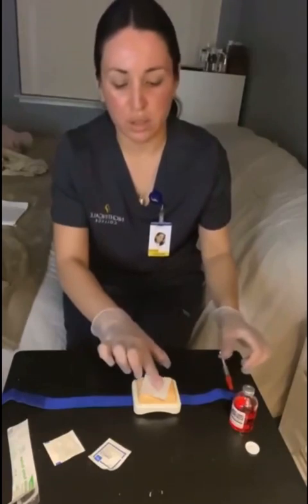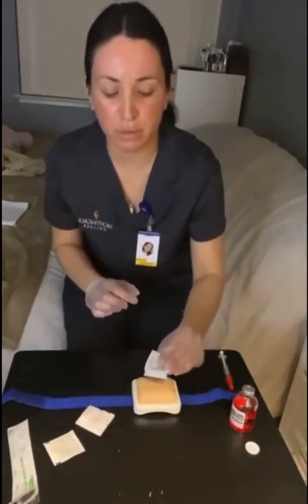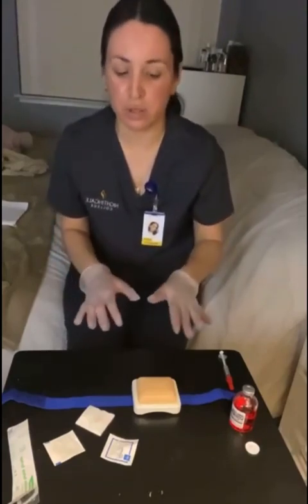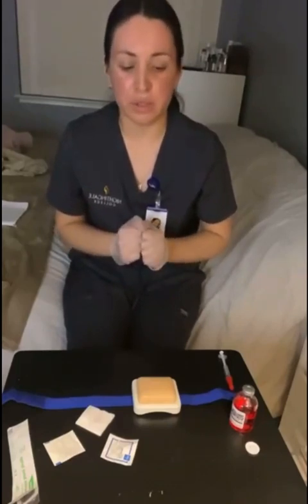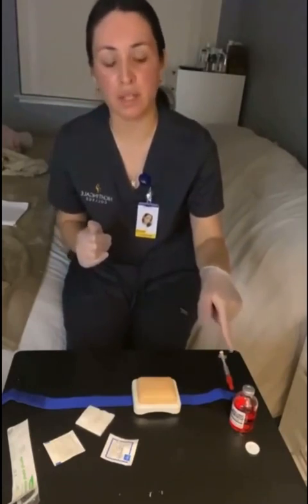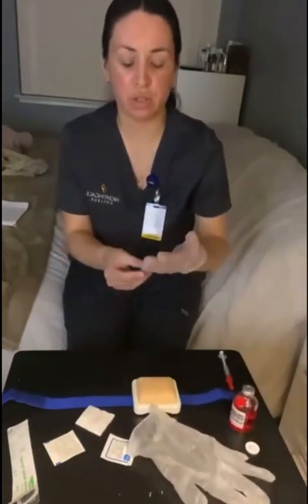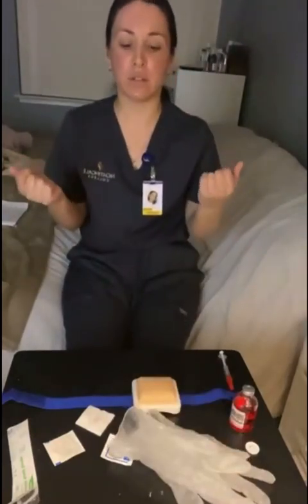And I would get another alcohol swab, clean, starting from the center, working outward about 2 inches, and use a Band-Aid if needed. Make sure an adhesive Band-Aid isn't going to irritate their skin. I would make sure the vial has my initials and date. Next, I would remove my gloves, place them in the trash, and document what I did.